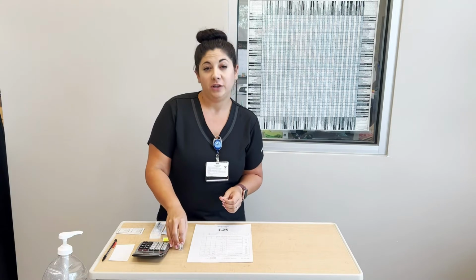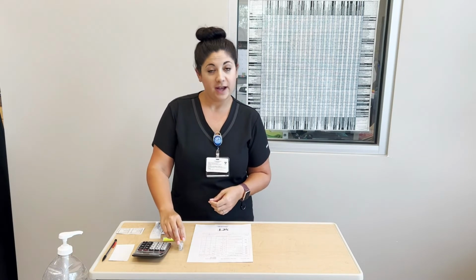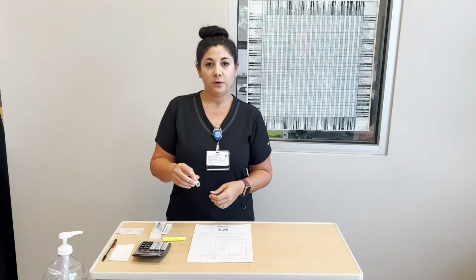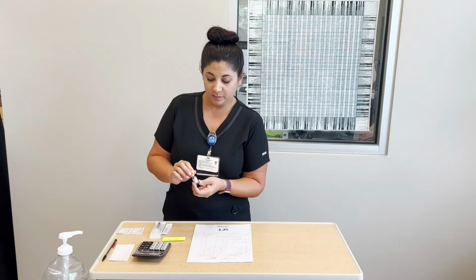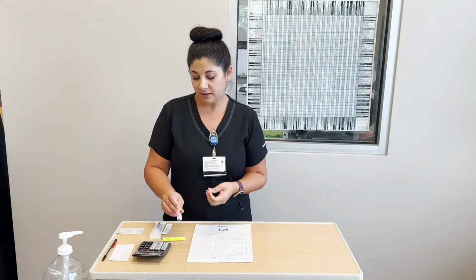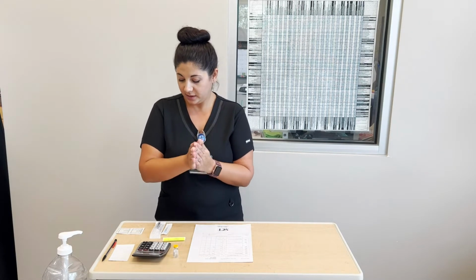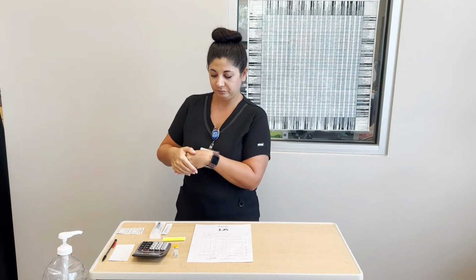Now I will pull out my drug cards so that I can do my calculations. You should have on your drug cards how fast you are able to give the medication. This medication I will be giving 1 milliliter over 1 minute. I'm going to go ahead and wash my hands and draw up my med.